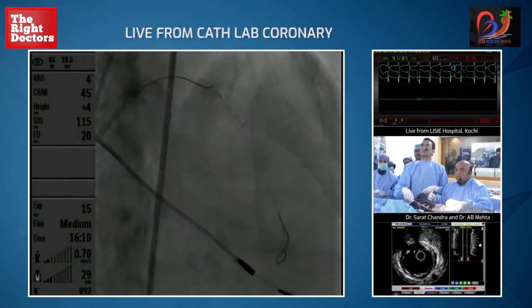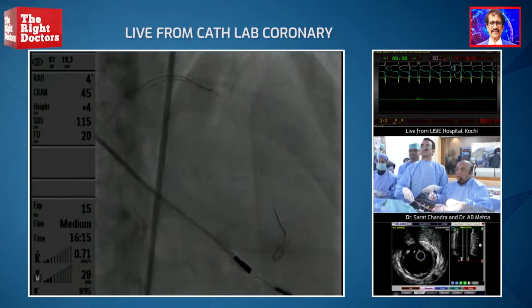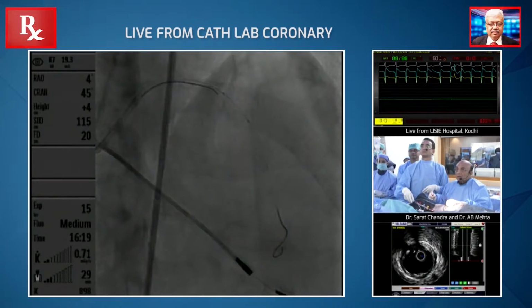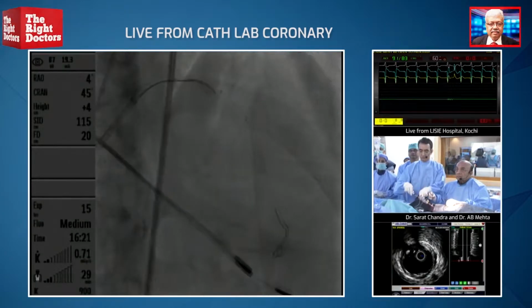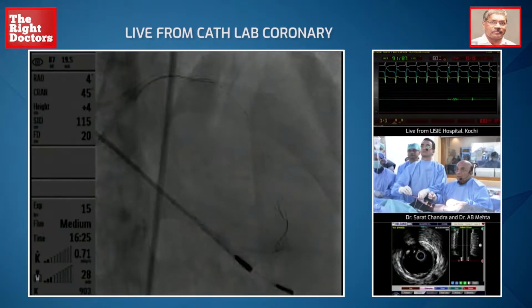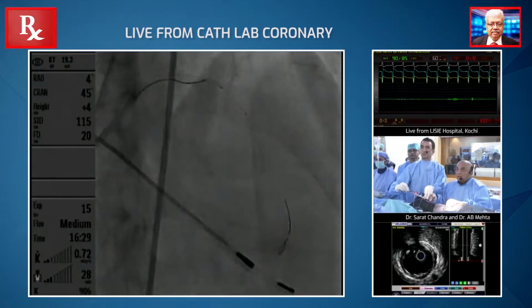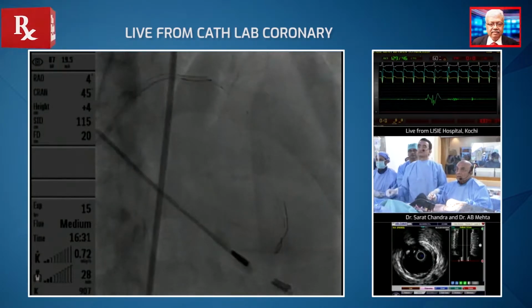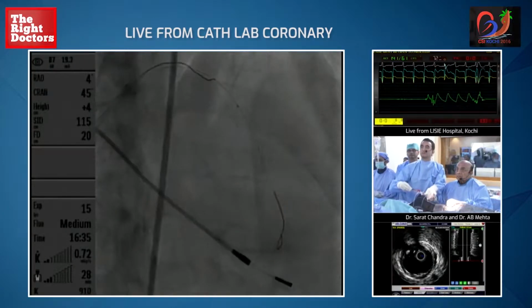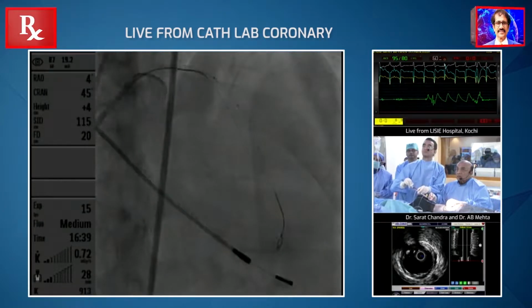Can we project the slides that we've got on iFR, please? Dr. Joe? iFR slides, please. You please continue. Okay, I'll carry on. Okay, so let's show you what we've done.